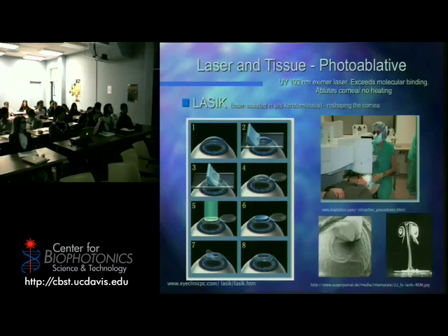I have a pattern that I've determined from doing some tests on your eye that tells me the exact shape of your cornea, and I can figure out where to remove cornea so that I can get your eye to focus on the back of your retina again. Once I've shaped it by removing a layer at a time in a very controlled fashion, I stick the flap back on. The flap will pretty quickly reattach, and you'll be fine, and you'll be able to see.